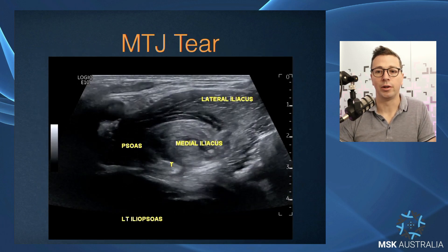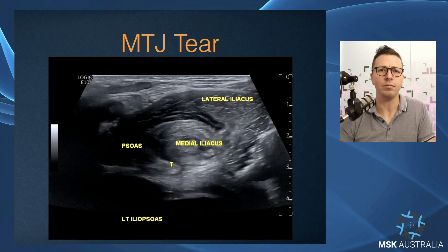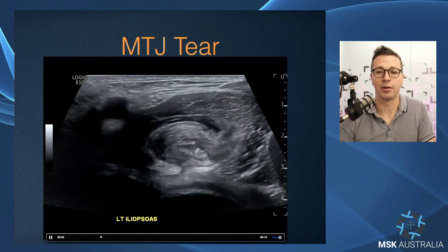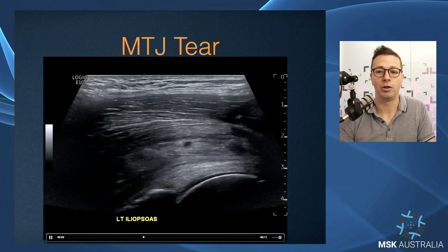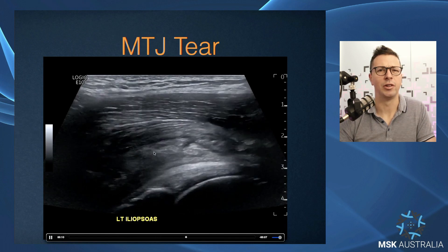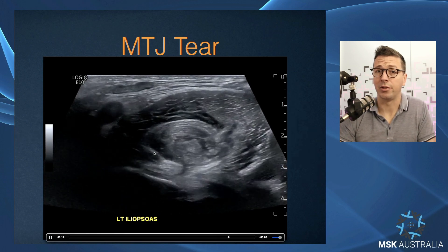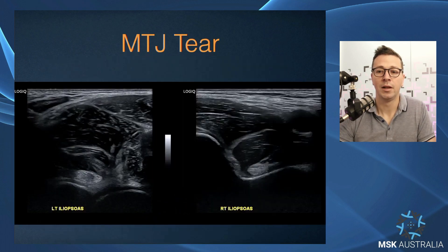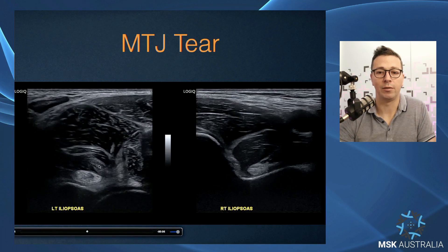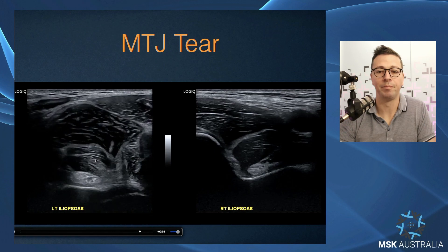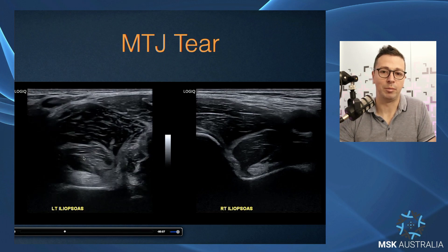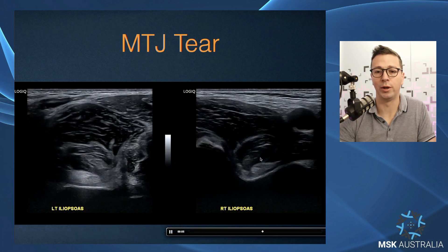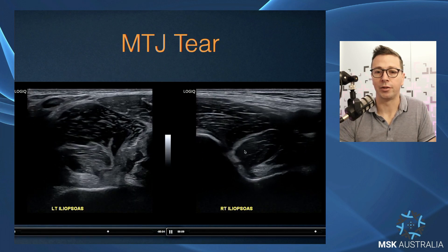The other pathology with iliopsoas is tears of the musculotendinous junction. When you tear your iliopsoas complex, you tend to tear the medial fibers of iliacus at the musculotendinous junction. In longitudinal we see that significant tear at the MTJ — just like most other muscle tears, they tear at the musculotendinous junction, which is the most common point of tearing pathology. In your hip flexor this is the medial fibers of iliacus. These tears can be quite small and subtle — compare to the other side for reference.